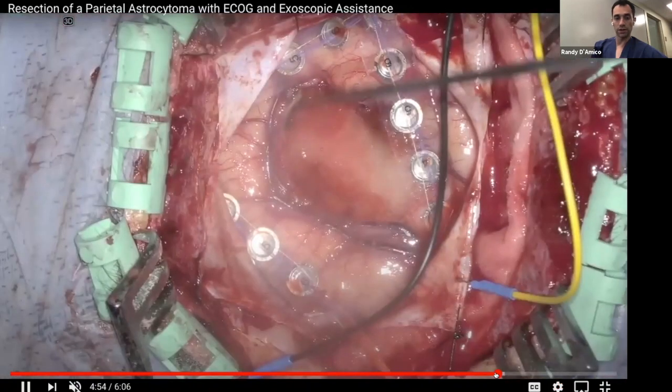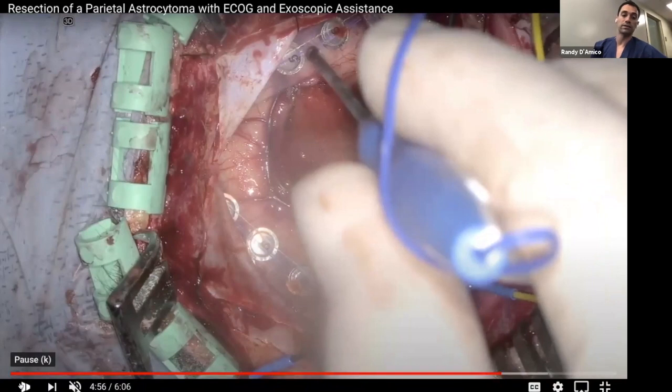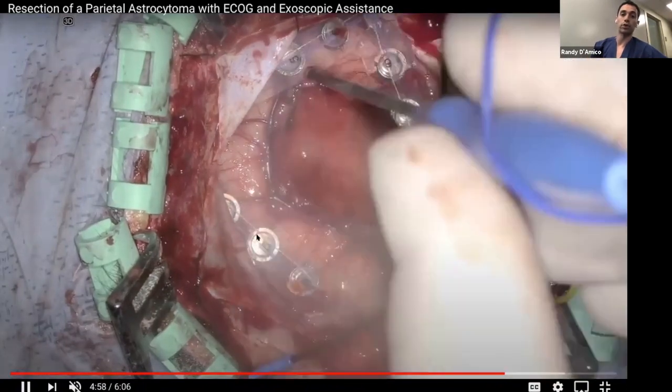Let's see. Now here's the ECoG component of this. So this is a stimulating probe and these are recording electrodes. And he's actually identifying where the motor strip is by stimulating. And then these can actually be stimulating electrodes also, sending transmission to the rest of the body that's being monitored so they can tell exactly where the motor strip was versus everywhere else.